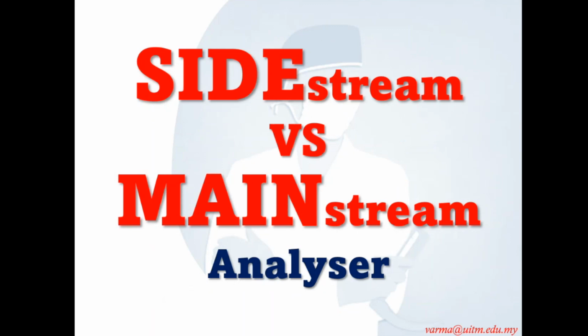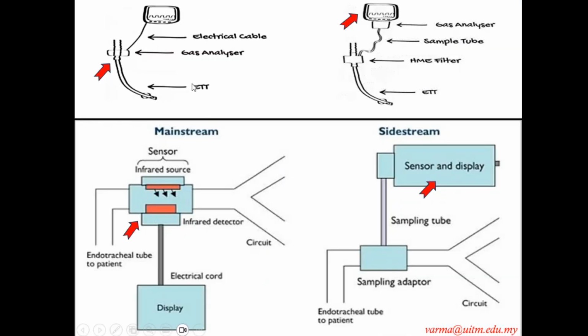That brings us to, so now we know carbon dioxide is measured by an infrared analyzer. Based on where these infrared analyzers are positioned in your circuit, that will determine if it is a side stream or mainstream analyzer. It's mainly based on the position of the analyzer in your circuit. If you have a mainstream analyzer, the important thing to remember is that it is immediately near your ETT.